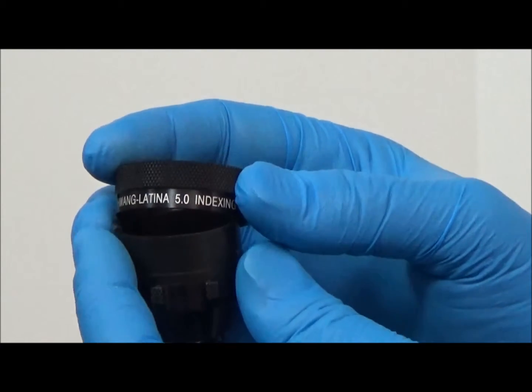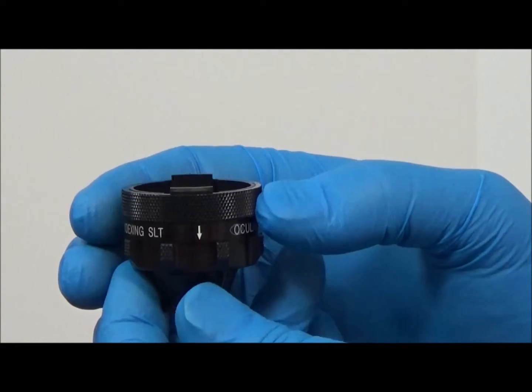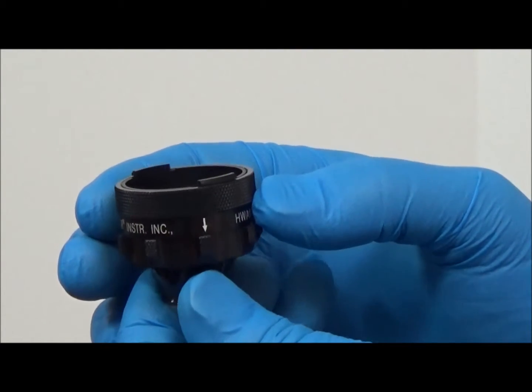To reassemble, simply slide the knurled rim over the tabs until it clicks into place. Note the direction of the arrows on the rim when reassembling the rim onto the lens — the arrows should point to the lens when reassembled.